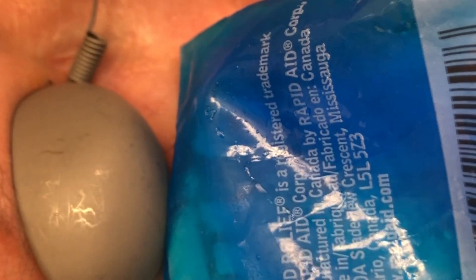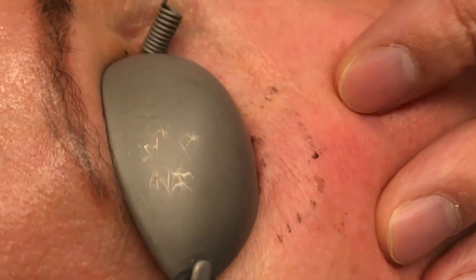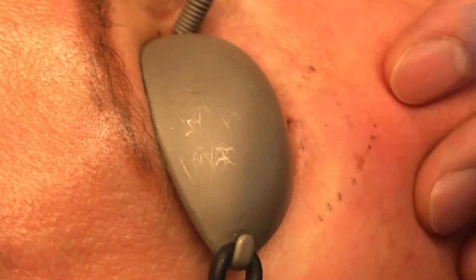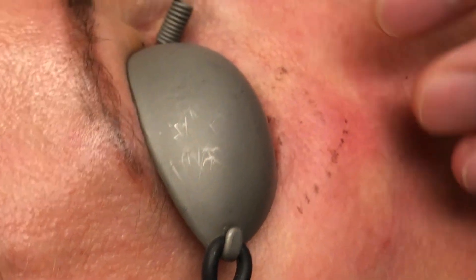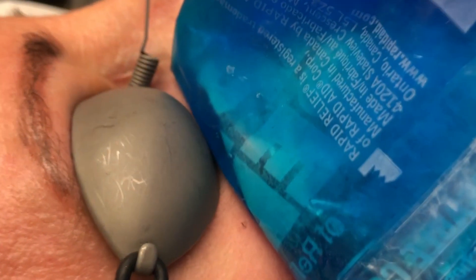So we're going to do some right over here. You can almost see it disappear. See how that's basically gone there? We'll do a little bit over here just to see where we can get. It's pretty neat how it just sort of disappears.